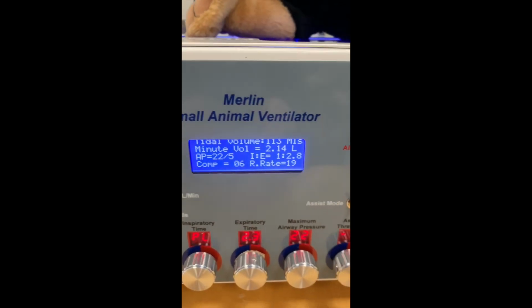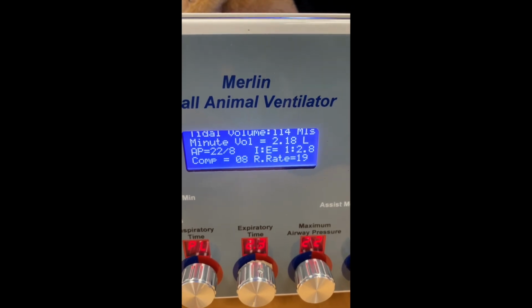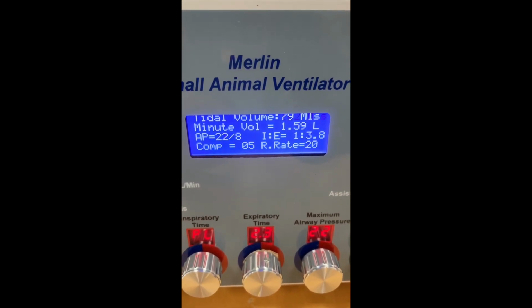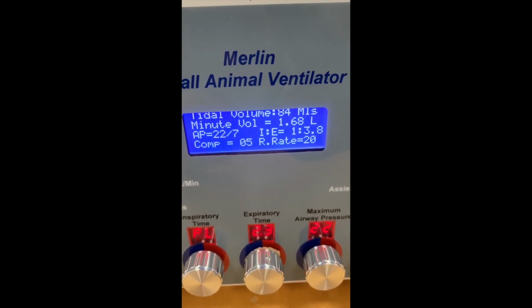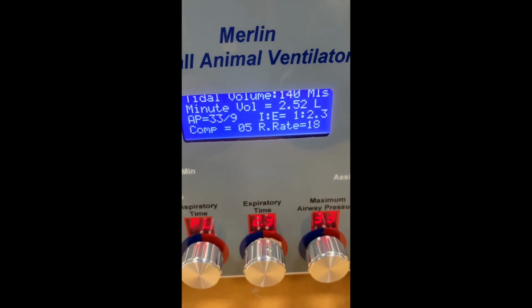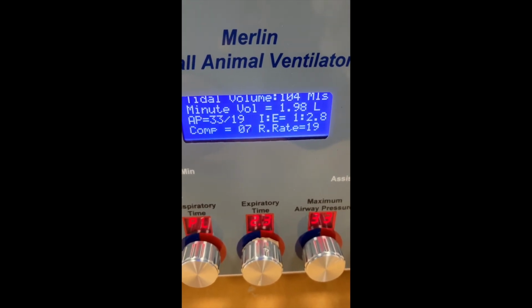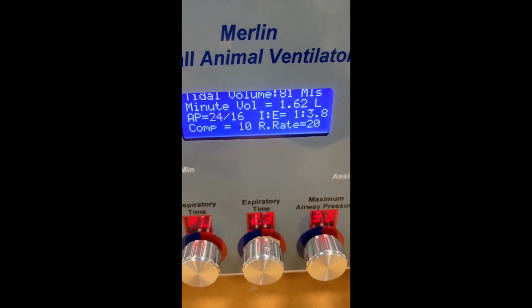Okay, I can increase or decrease this PEEP value up to, our standard valve goes up to 25 centimetres of PEEP and down to 1 or 2 centimetres. However, we can make PEEP valves to almost any specification. So I've turned up the target pressure and I'm just increasing the PEEP just to demonstrate the effect. Okay, so now we have 18 centimetres of PEEP.